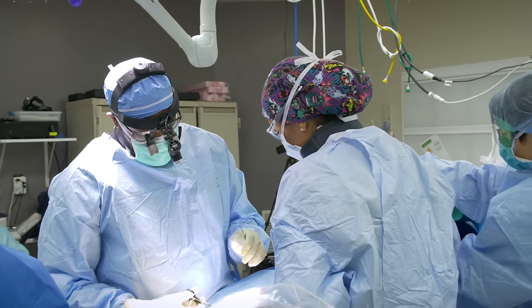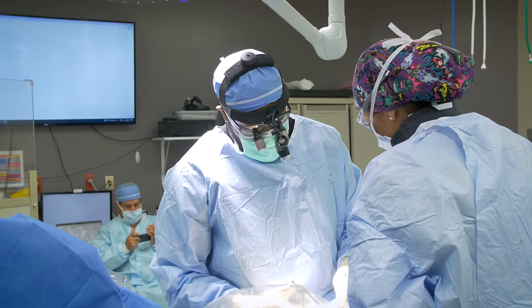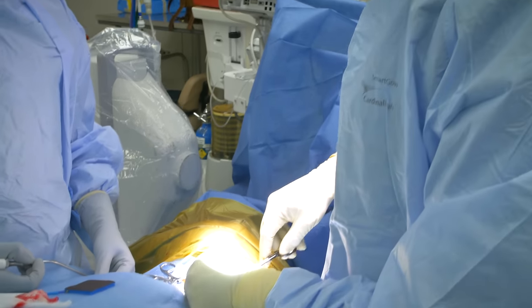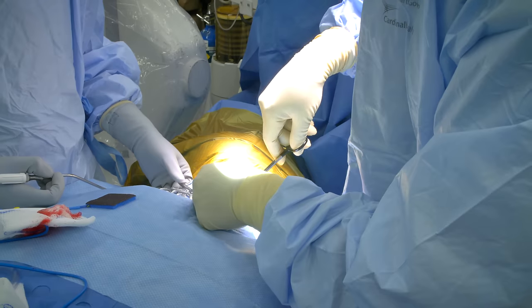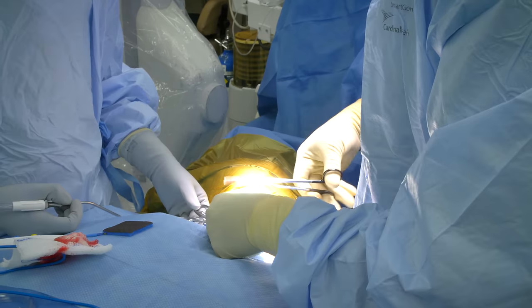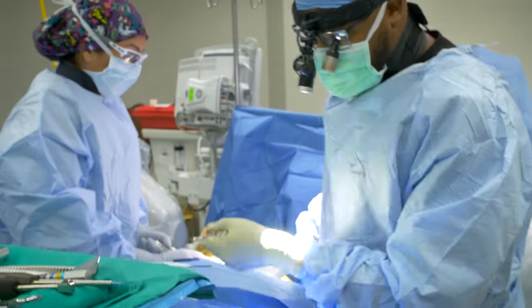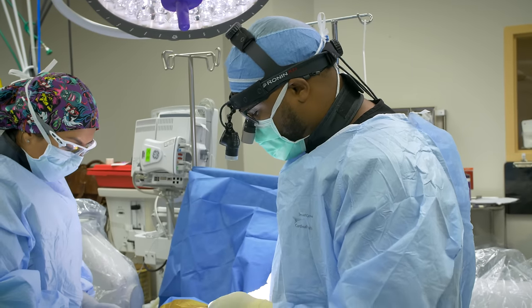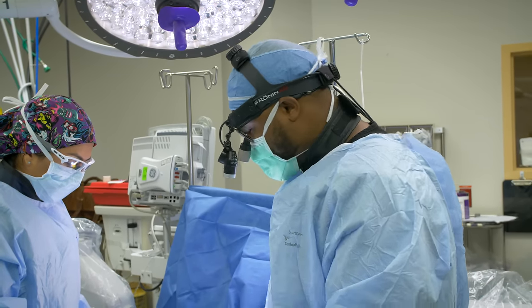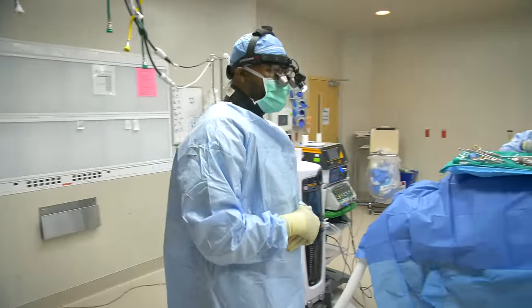We just made our incision on the anterior portion of the neck. I'm going through the muscle called the platysma — that's one of our landmarks. This is the sternocleidomastoid muscle right here, and I'm finding the plane between the esophagus, the trachea, and the sternocleidomastoid muscle. That's the plane I'm going to go through to get down to the anterior portion of the spine. In about 45 seconds, I can already feel the front part of the spine, and I can feel the carotid artery — it's lateral to me, which lets me know I'm in the right position. I put a needle into the disc space and we're going to localize to confirm what level we're at.